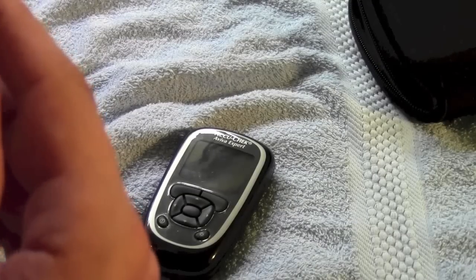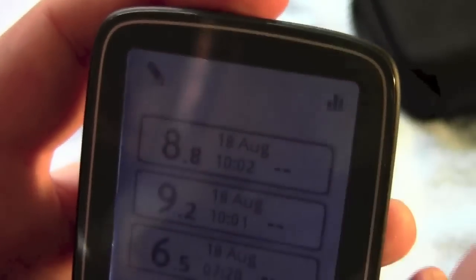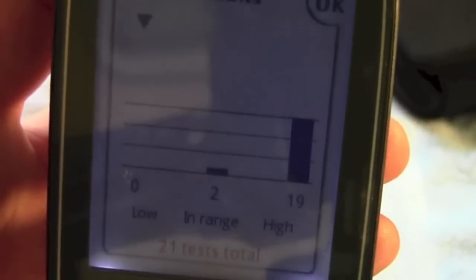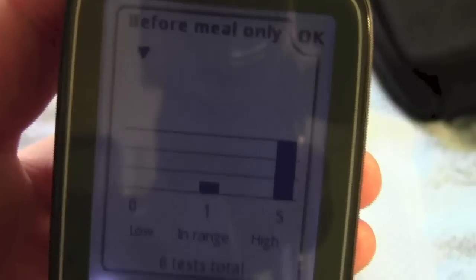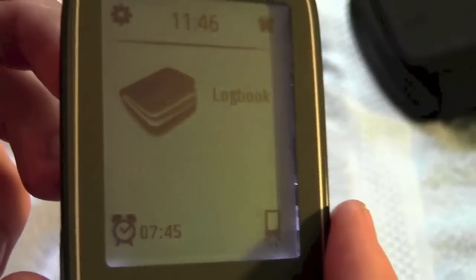Both of these meters have on-device reports. On the Insulinx logbook, there's a little chart symbol. It gives basic information — it says I've done 21 tests in total, 19 were high, 2 were in range, and 0 were low. You can filter these to show before-meal results only. That is about as advanced as the on-device reports get on this meter.